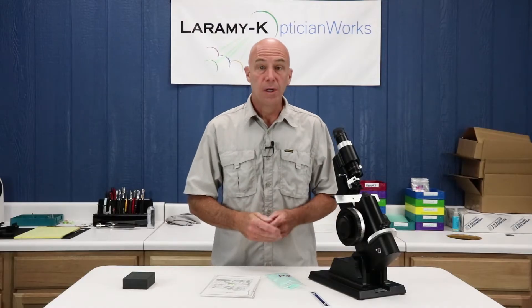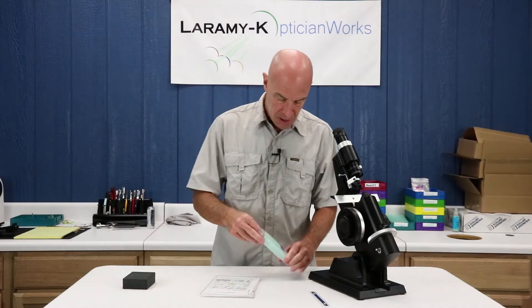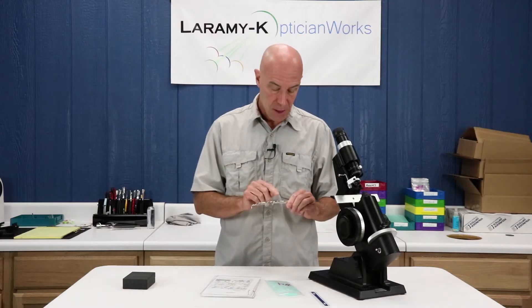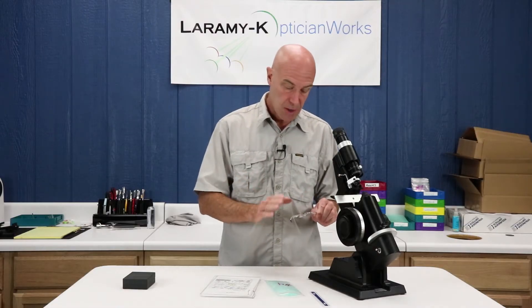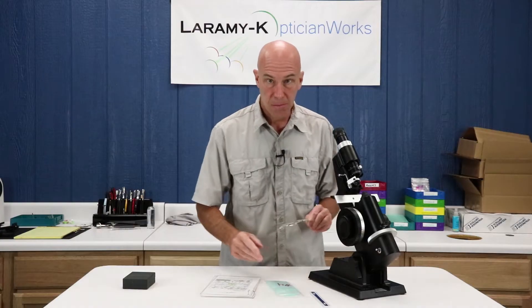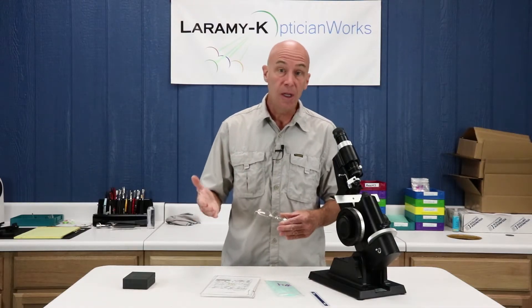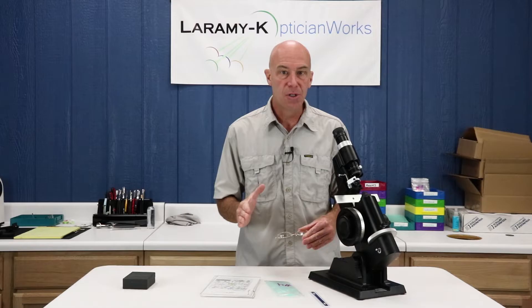Kit number four is another mounted pair. Go find number four, double check your etched mark to make sure you have the right frame and right lenses in the right bag. You will notice when you look at it that it is a lined bifocal. We're going to build on what we've already been doing and add in a couple of new steps.